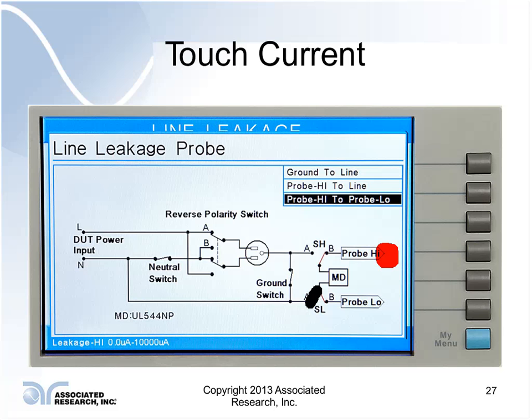So what we're doing in this particular case is we're still powering up the device. So our device is plugged in right here, and we're bringing in power here with our various fault conditions. We're powering it on, and now since we're powering on our product, it is a source of leakage current. And you're going to have some leakage current flowing back to this patient lead. So what's going to happen is leakage current is going to flow from your probing point through your measuring device back to your same reference point.